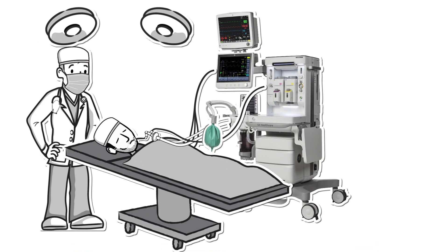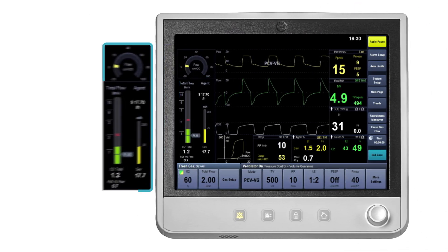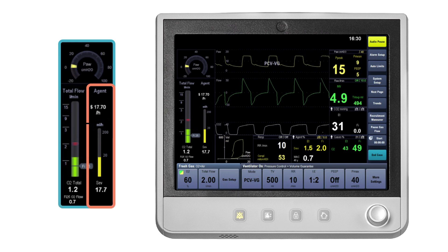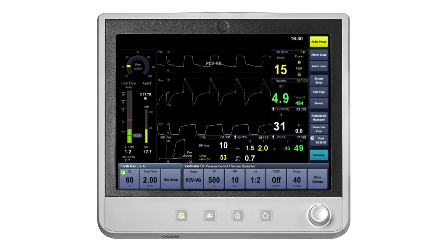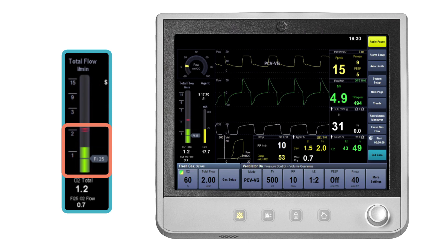What is EcoFlow? EcoFlow is an application to help aid the clinician with the delivery of low flow anesthesia. The EcoFlow split screen consists of the O2 total flow tube, minimum FiO2 marker, and the agent flow indicator. The O2 total flow tube will provide the clinician with the amount of oxygen that is being delivered in the fresh gas flow. The single flow gauge is stacked to show the total oxygen and balanced gas, either nitrogen or nitrous oxide.